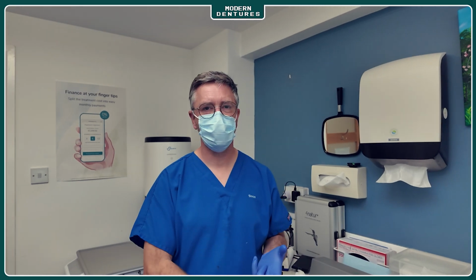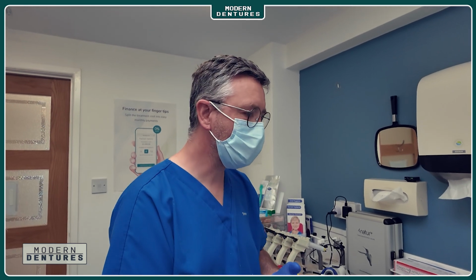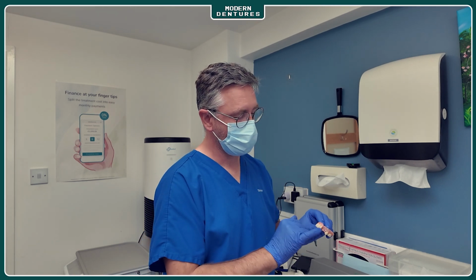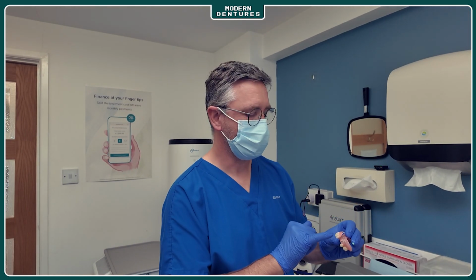A lot of clinicians will just rely on their technician to do the mould. I do sometimes if it's very straightforward, but quite often I like to give the mould, especially if it's an upper denture, and making sure that we get the right size upper anterior teeth.